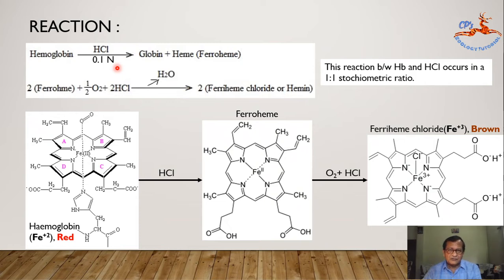If we use a hypertonic solution, an isotonic solution, or concentrated hydrochloric acid, or an alkali medium other than hydrochloric acid, the results will not be up to the mark, because the hemoglobin structure will react otherwise and constitute a different type of hemoglobin molecules.